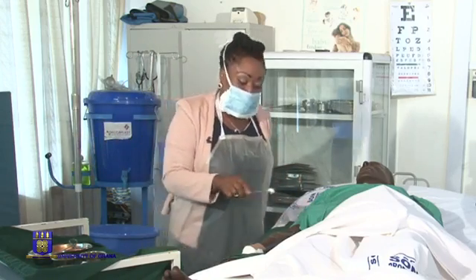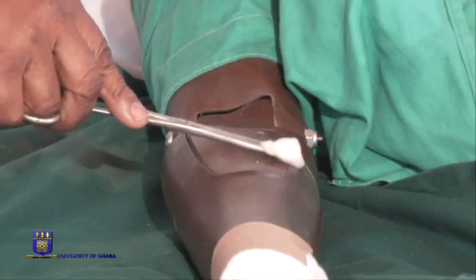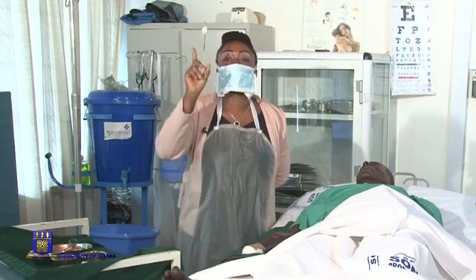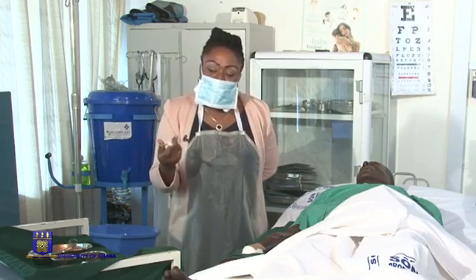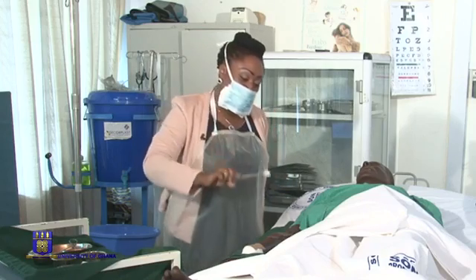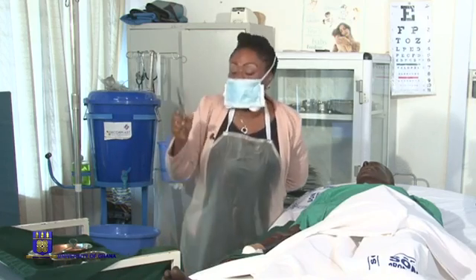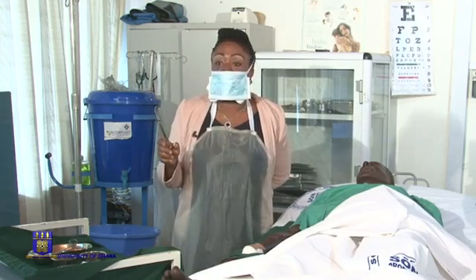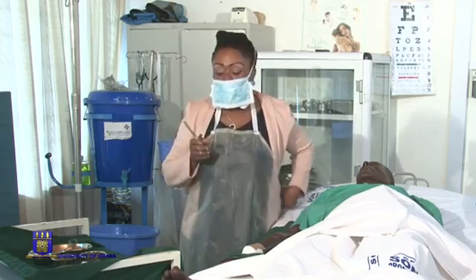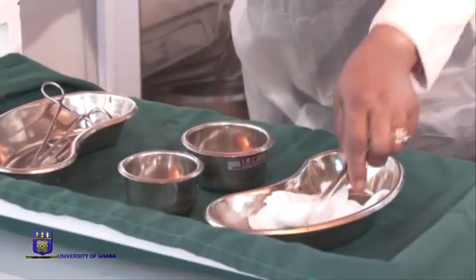So we now come to the cleaning itself. Sorry, Mr. Osei, it's not comfortable. I know you are going to feel pain. Please, you clean using one surface of the swab once. With experience, people are able to turn, but please, as a student, use one surface of the swab once, and then you release it into the receiver. As you do that, you make sure you don't contaminate the forceps. So we continue cleaning the wound until it is very clean.